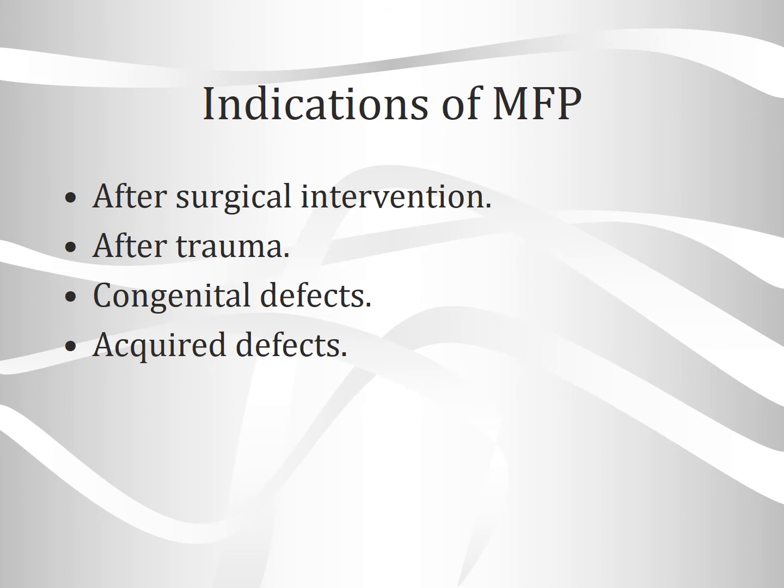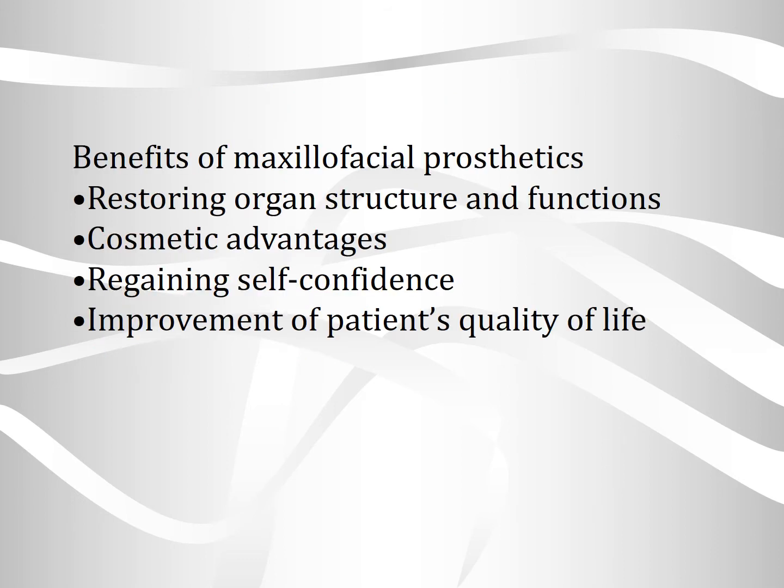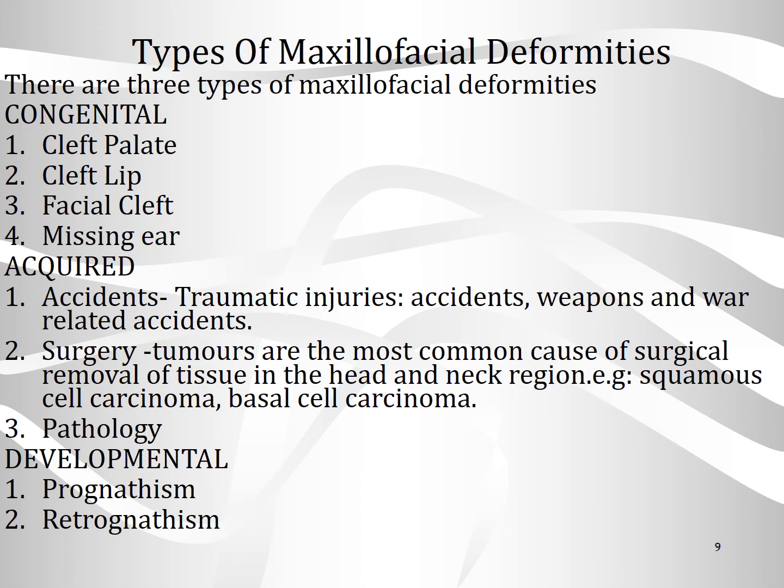So, indication for the MFP, that is the maxillofacial prosthetics, is after surgical intervention, after trauma, congenital defects, and acquired defects. Benefits of maxillofacial prosthetics is restoring organ structures and functions, cosmetic advantages, regaining self confidence, improvement of patient's quality of life.